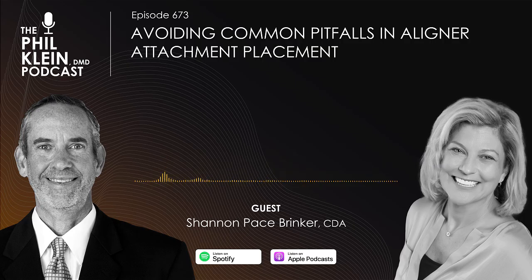Right. Now, the dental assistant is the one doing this, right? So they need to get the training. Where do they typically get the training on placing the composite inside the template and applying the template and making sure the shape is correct by removing all the flash? And we're going to go over some of these details on this podcast episode. Yes. But where does the assistant get that training?